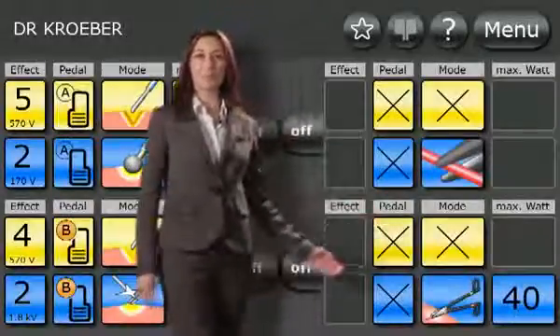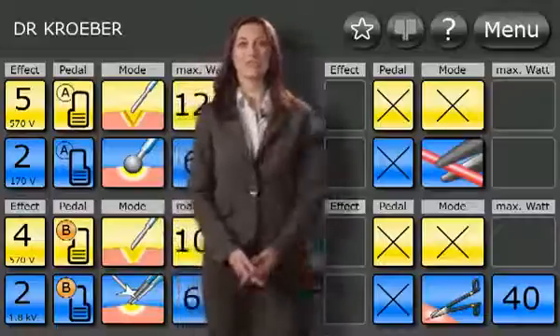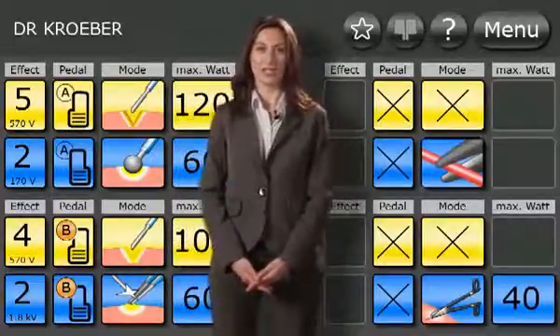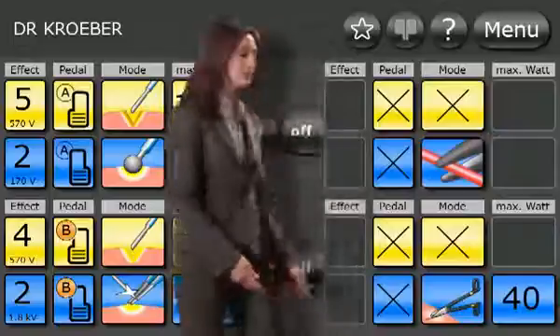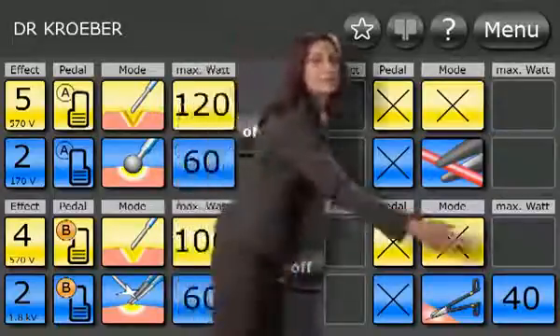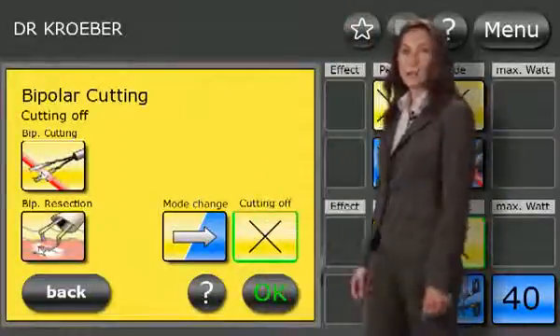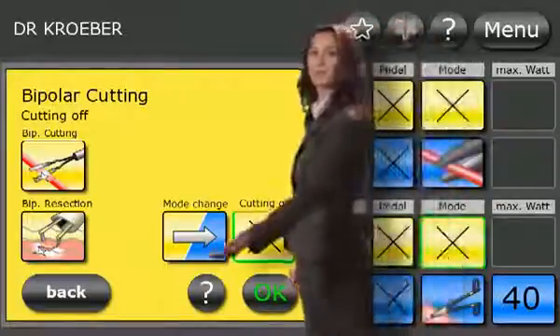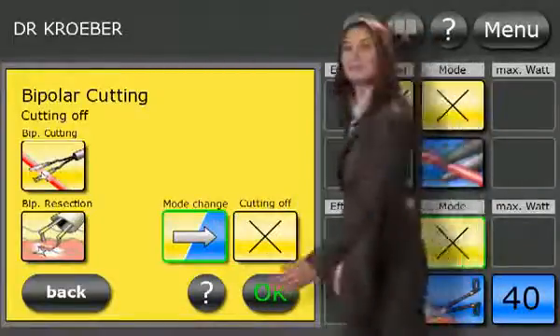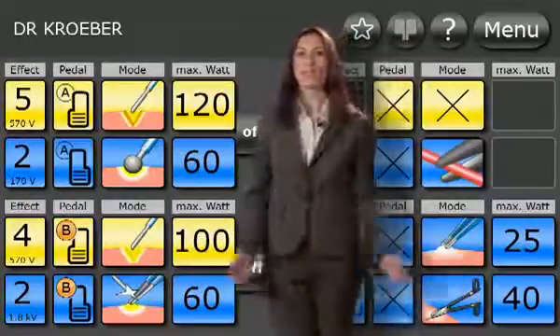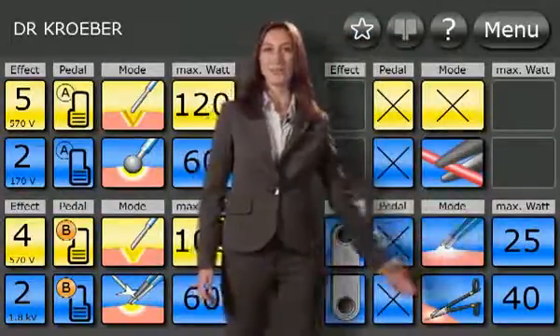The lower bipolar socket can be split, which means that you can connect a total of three bipolar instruments. Touch the switch button in the mode selection to change to coagulation. Now three bipolar connections are at your disposal.